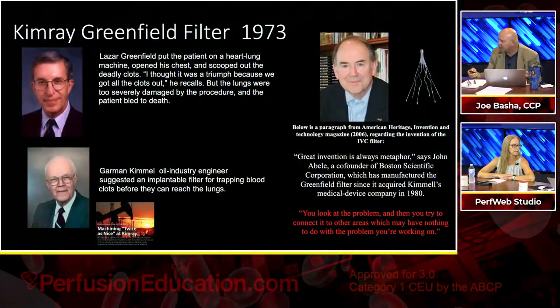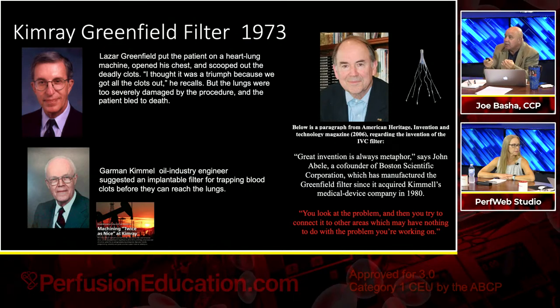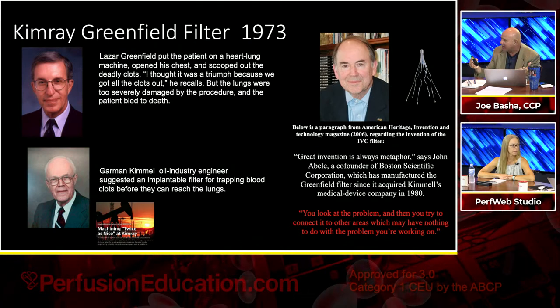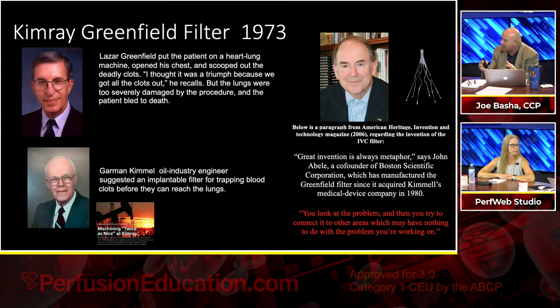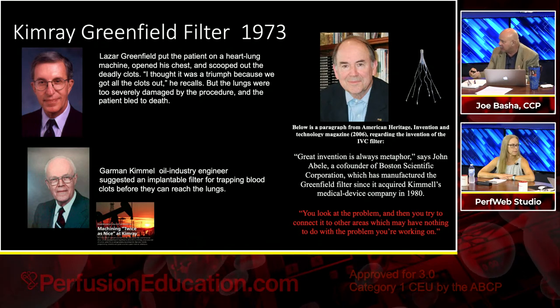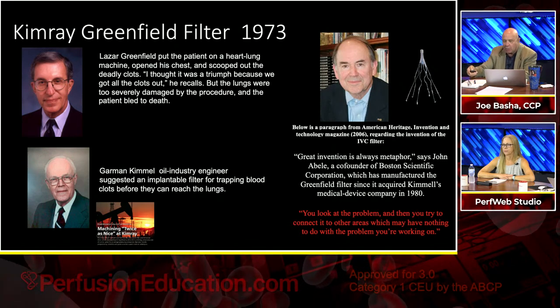But this is a perfect example, the trilogy, if you will, of cross-industry collaboration between a heart surgeon who identified a problem and was able, with the right tool or product, to help patients with that problem; an engineer who had the mind to understand flow characteristics in the venous system and laminar flow and all of the things you need to make a device that would not obstruct flow but would stop clot; and then, of course, the industry person to take that and get it built and distributed so that it could be used on a wide scale for patients the world over. So that's the story of the Greenfield filter.